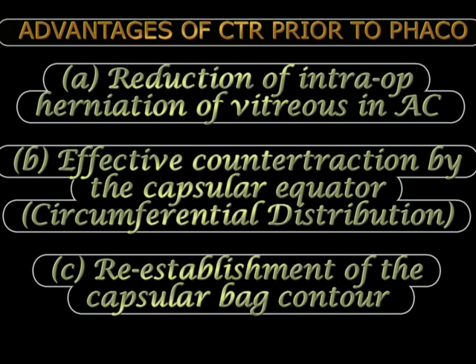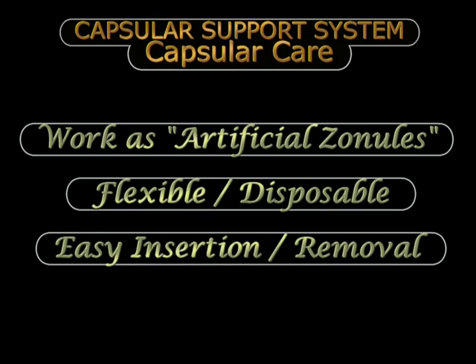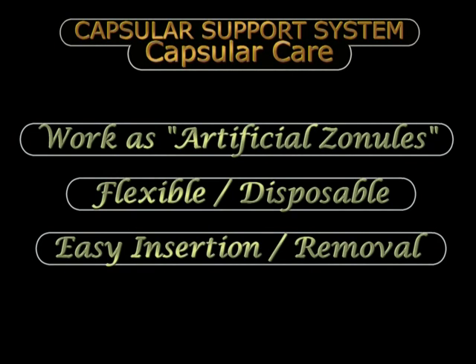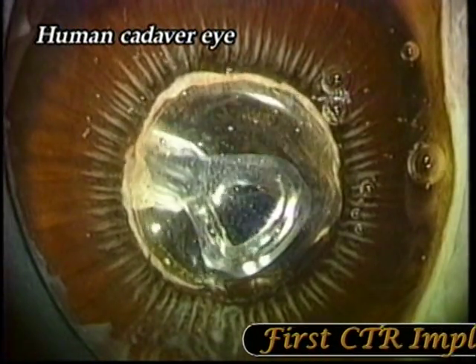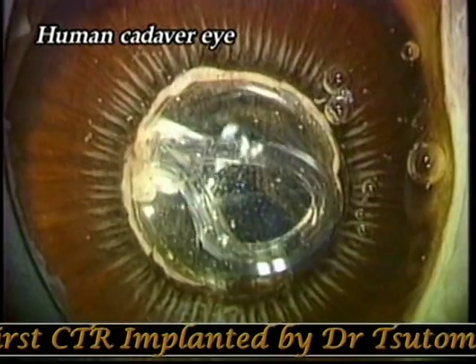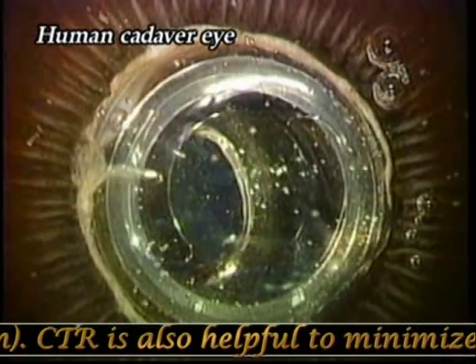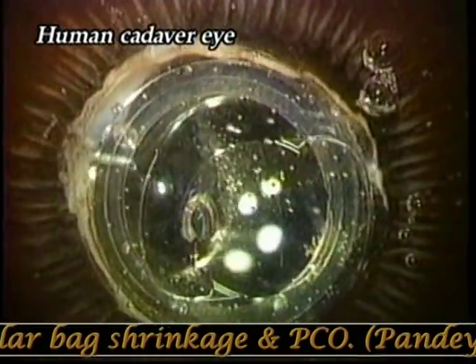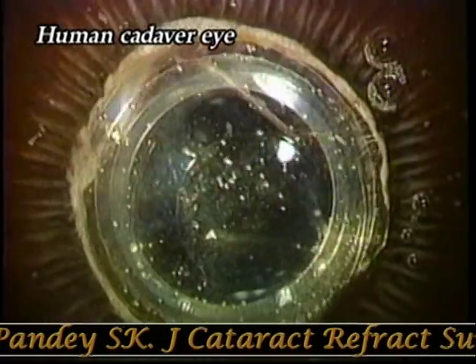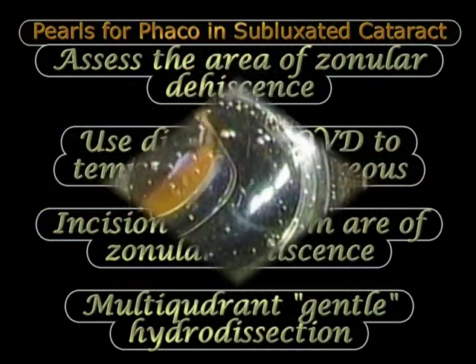The advantages of capsular support systems or capsular hooks are that they work as artificial zonules, can easily be inserted and removed, and are flexible and disposable — though additional paracentesis incisions are required. This is a Miyake-Apple view of a human cadaver eye showing the first CTR implanted by Dr. Sutomo Hara from Japan, demonstrating how well the capsular bag is centered after CTR injection, allowing the IOL to be implanted exactly in the capsular bag. Studies have also shown that CTR implantation reduces posterior capsular opacification post-operatively due to equal stress distribution.